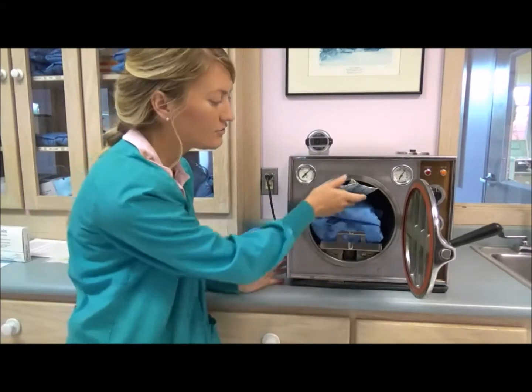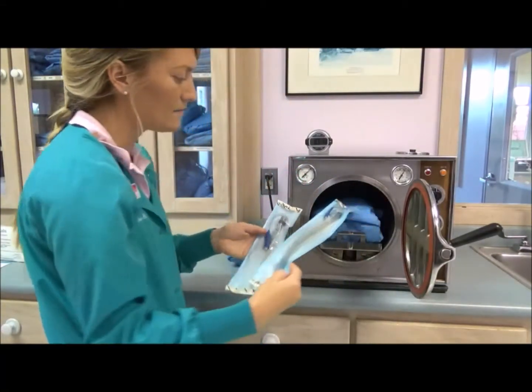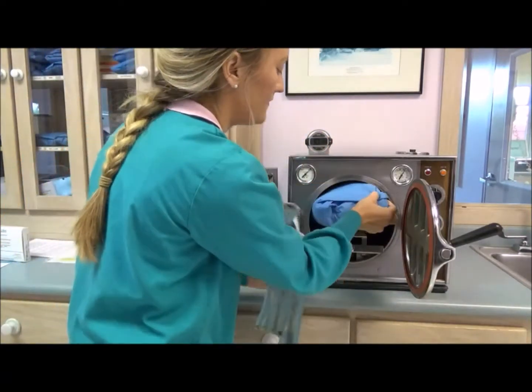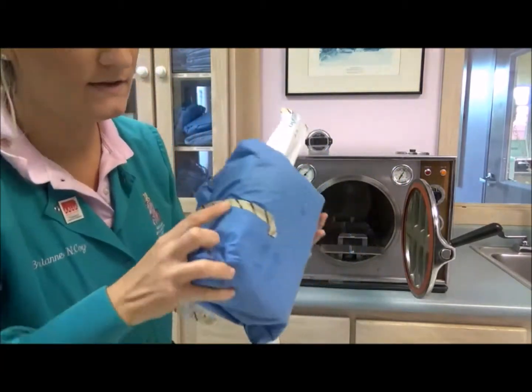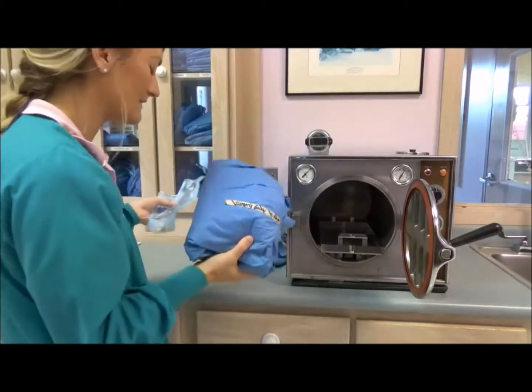To ensure pack sterility, you can look at the steam indicator tape on the outside of the packs. And if you see the black lines on it, then that means that steam properly penetrated the tape, the packs itself.